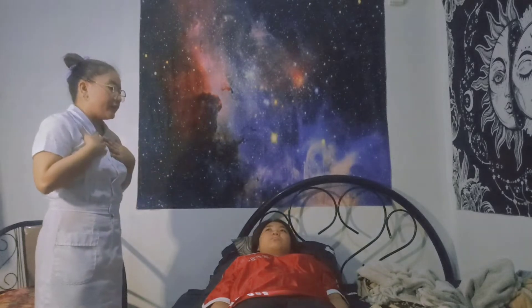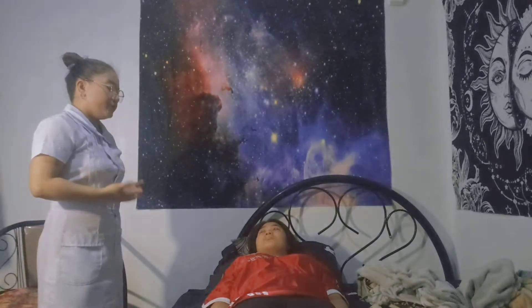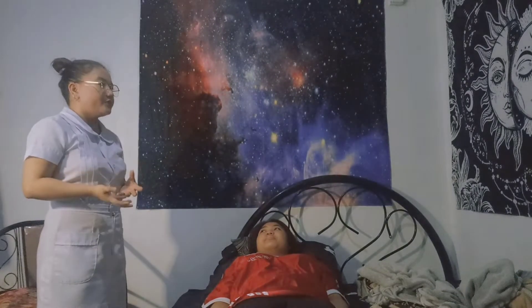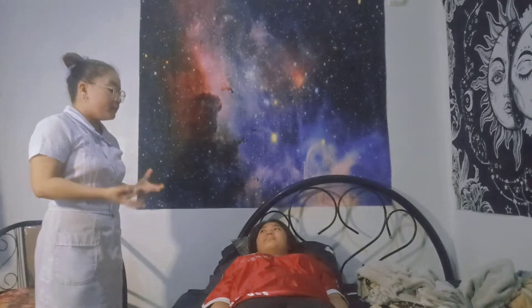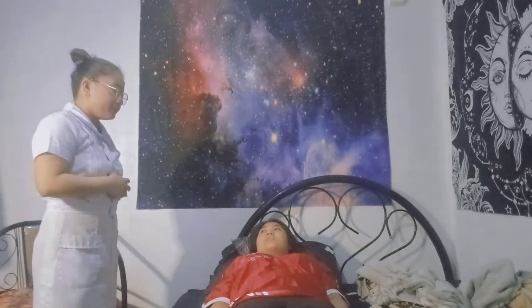Hi ma'am, I'm Ira Camille and I will be your nurse for today. May I know what your complete name is? My name is Edris Megan. So for today, I'm going to transfer you from your bed to your wheelchair. Is that okay, ma'am? Yes, it's fine.